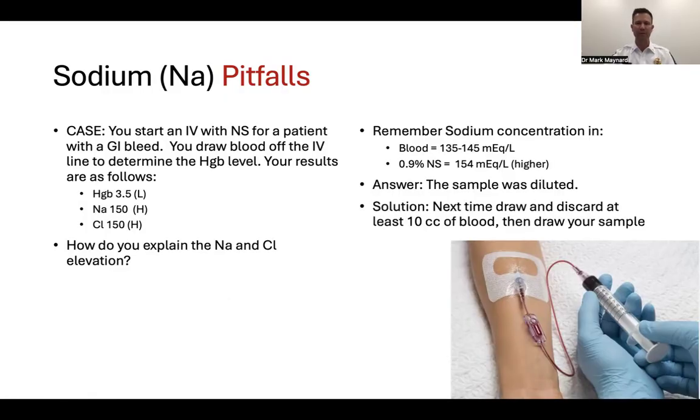All right, so what do we do? Well, next time we're going to draw and discard at least 10 cc's of blood from that line if there was anything running through it, and then redraw and resend your sample.